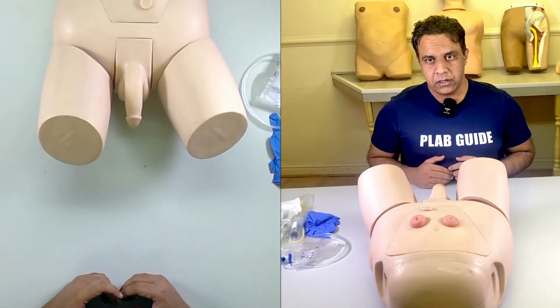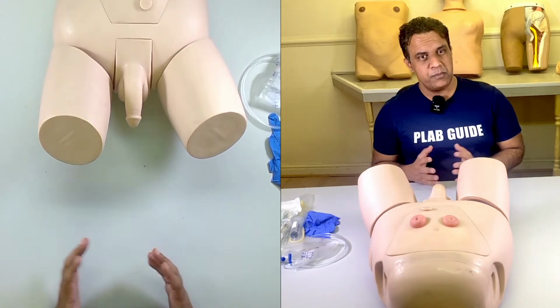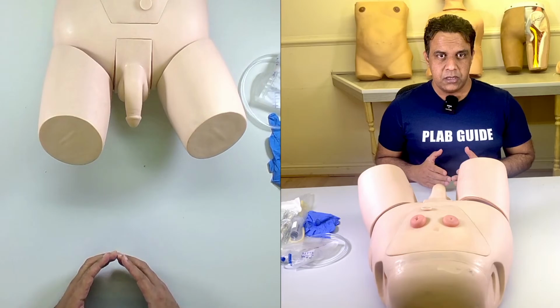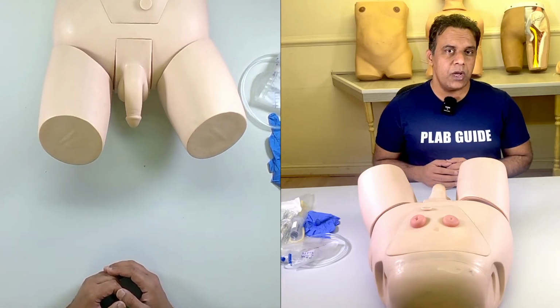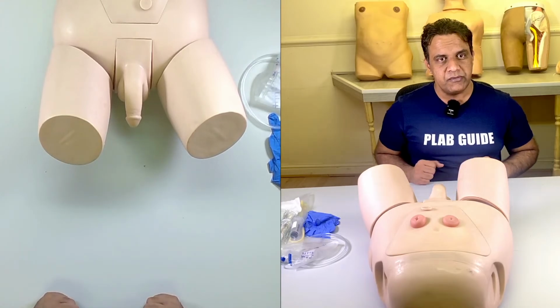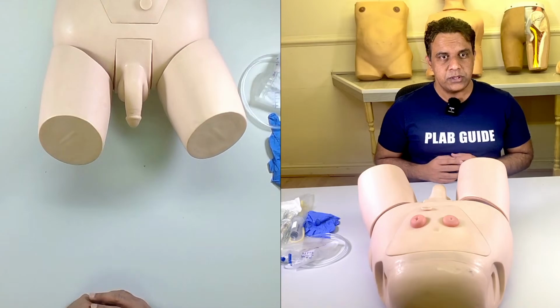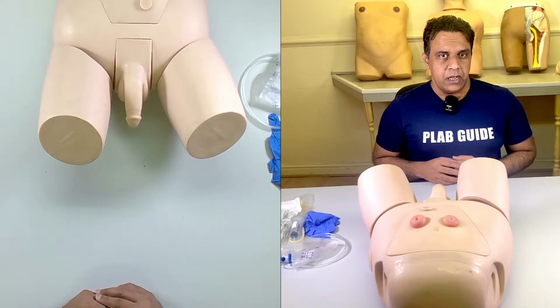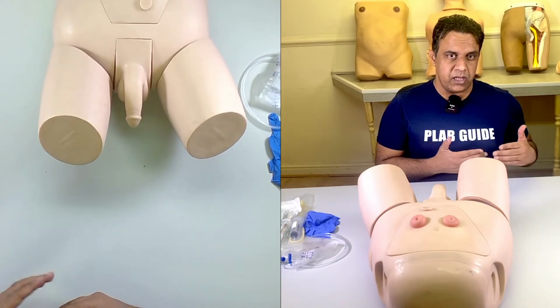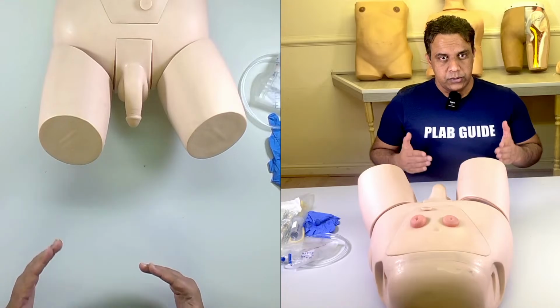Hello everyone. Today I'm going to teach you the male catheterization. It is a very important skill that you need from the examination point of view as well as from the clinical point of view. You may see many patients coming with urinary problems. You may need the monitoring of the patient when you are treating the patient for sepsis, and many of the time the patients may require catheterization as a part of their post-op recovery. So this is a very important skill.